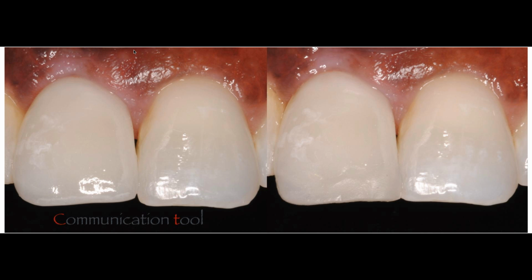So how do we communicate with the lab? How do we tell the lab we're having this problem? It doesn't show up in the cast, but we still need you to resolve this problem. But we don't want to take a new impression. We want to do something simple. So what I did for this patient is I added some resin composite to the incisal edge, as you can see in the photo on the right.